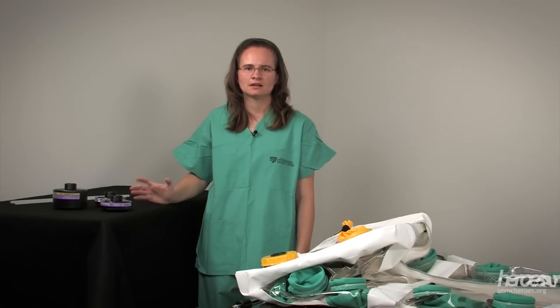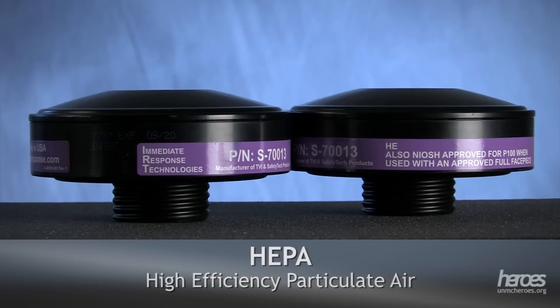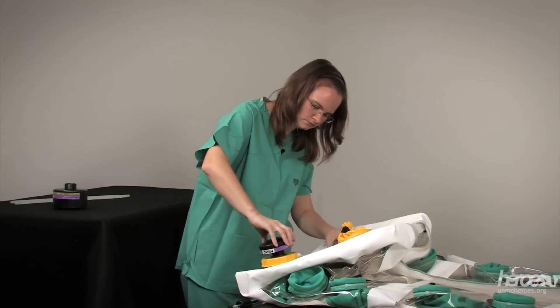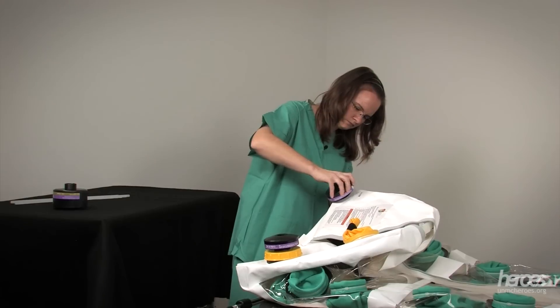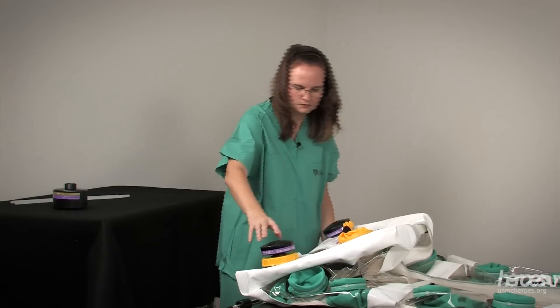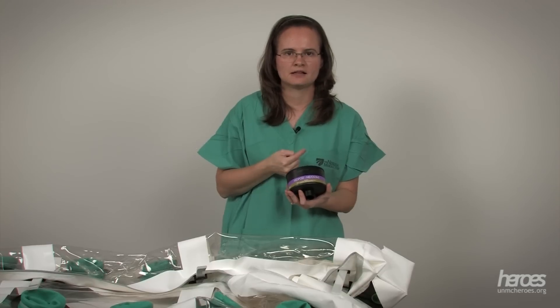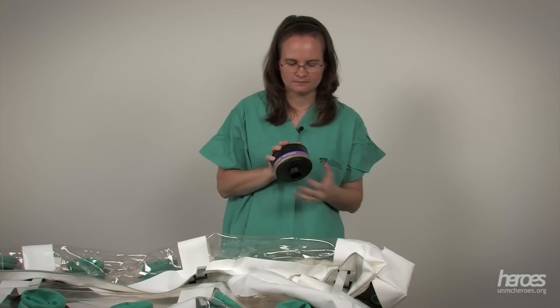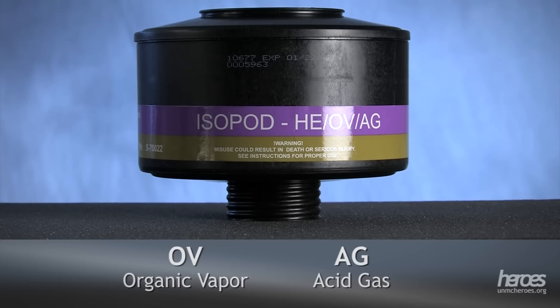There are three filters that need to be attached to the isopod. Two of the filters are HEPA filters. We're going to use these particulate filters on the external side of the isopod at the head end. The third filter goes on the foot end inside the isopod. This is the most important filter because it's the last filter before air leaves the isopod. This filter is special because it's not only a HEPA filter but it also filters out organic vapors and acid gas.